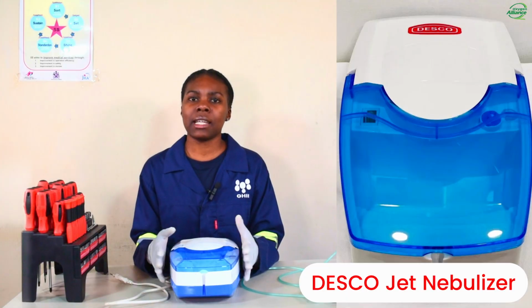In this video, we'll be working with a Desco jet nebulizer. Like other jet nebulizers, this nebulizer uses pressurized air to convert the liquid medication into a fine mist. It has a power rating of 130 watts and it operates on 220 volts AC at a frequency of 50 Hz. This jet nebulizer assembly consists of a nebulizer kit and a compressor unit.